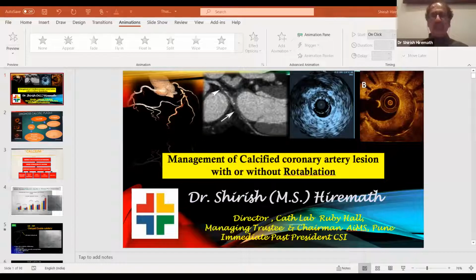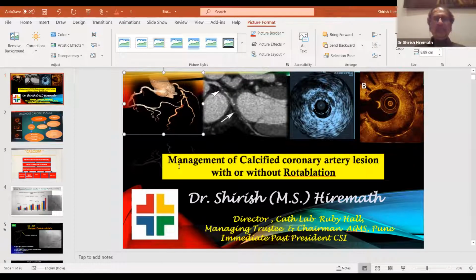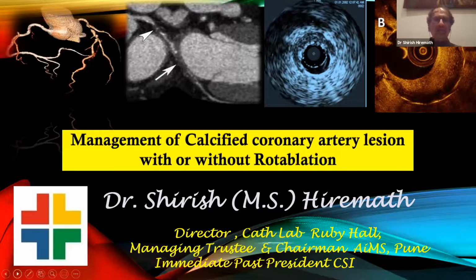If you see the history of angioplasty, how it has grown, you would realize that angioplasty approached simple lesions first, then multiple lesions, then complex lesions, bifurcation, left main. So these were conquered one by one. Today, what we still struggle with are CTOs, because they need a different kind of technique, and also calcific lesions, which are very hard to break and expand.